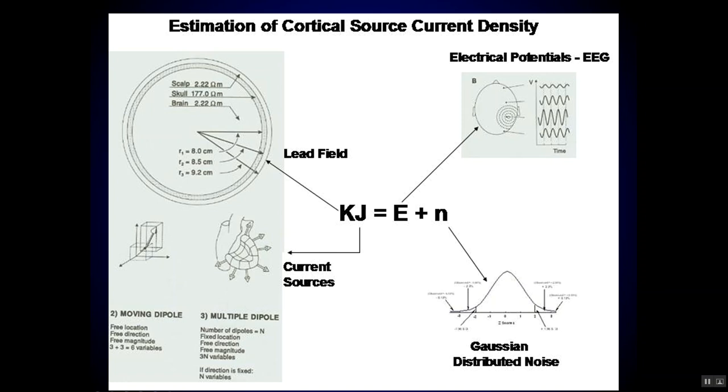As you rotate that battery, you would see the electrical potential also move, and that is what's called the forward solution. That is, you put a current in the interior of the brain or the interior of a volume. This could be a balloon with sensors on the outside, and you move that source of the electrical potential around, and the predictability of what the potential will be at the scalp surface is extremely high.